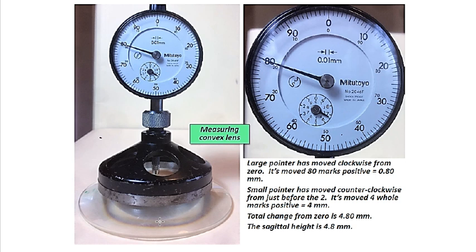Now we're going to put this convex lens in, so the convex lens is going to raise the stem up, therefore our reading is going to change in your dial gauge. So how much has it changed? It's going to move up about 80 marks. So start out with 0 and go ding, ding, ding, all the way to 80 and stop. And then the small dial is going to show you about 4 millimeter, because it has to move about 4 whole marks to the positive side.